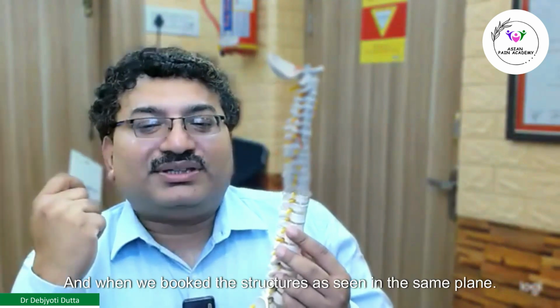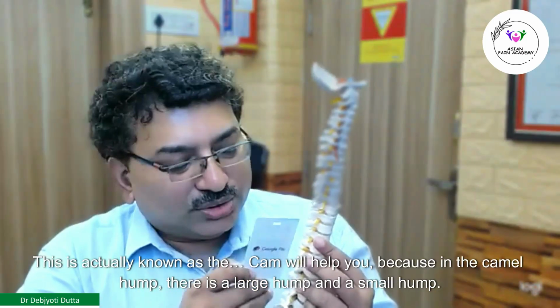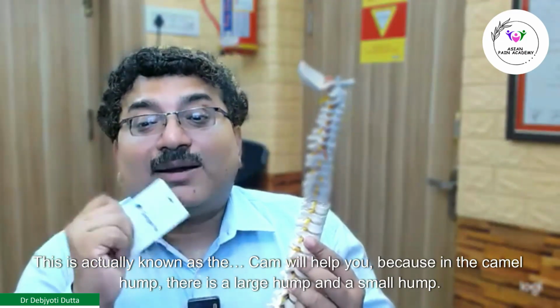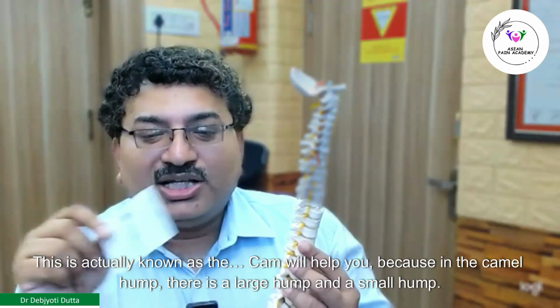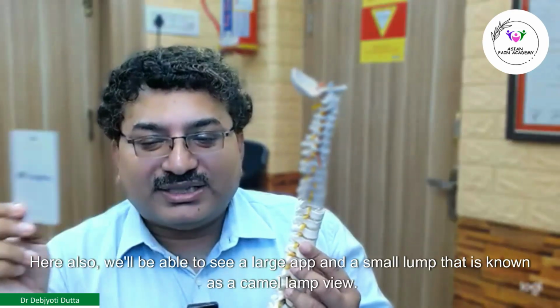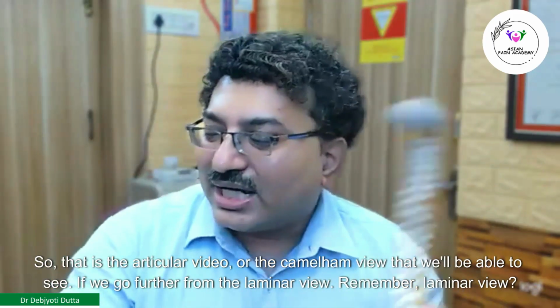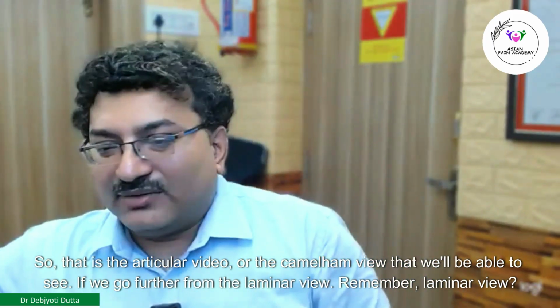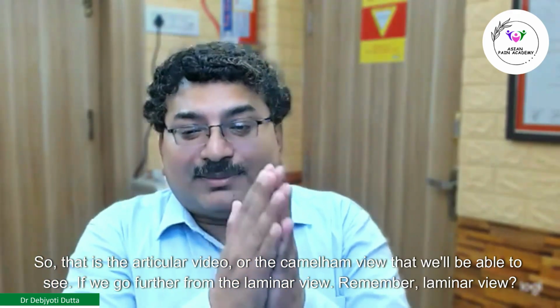And when both the structures are seen in the same plane, this is known as the camel hump view, because in a camel hump there is a large hump and a small hump. Here also we'll be able to see a large hump and a small hump. So that is the articular view, or the camel hump view, that we'll see if we go further from the laminar view.